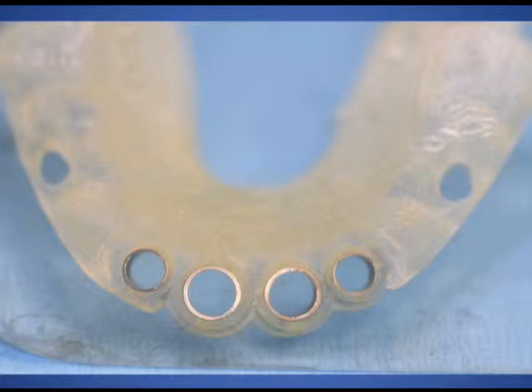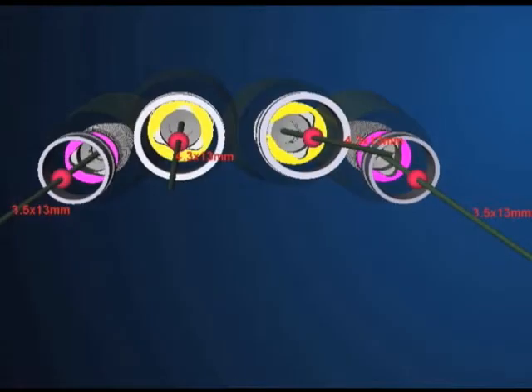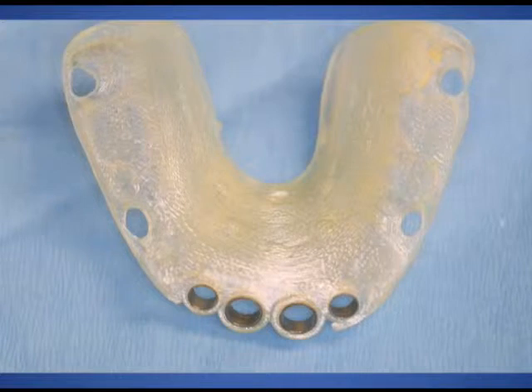To do this, we would create a surgical stent in the dimensions regulated by the parent company. But the challenge would be the metal sleeves or rings that would allow us to place the implants in the correct position. How could we stabilize those rings appropriately to use it as a surgical guide? The acrylic that was used would be an overlay similar to a bite splint. It would have to be stable, not move, and allow us to position the implants correctly.